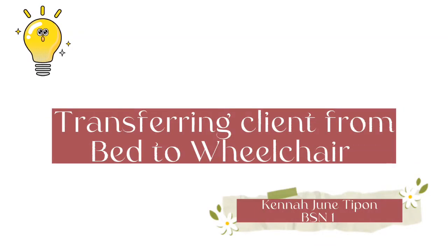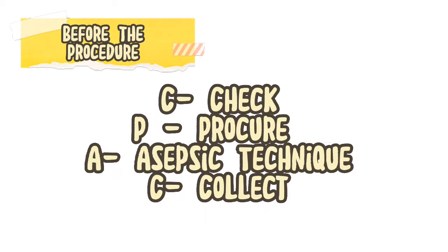Transferring client from bed to wheelchair. Before the procedure, remember the acronym CPAC. C. Check. Check records, medication record, or obtain an order if necessary.